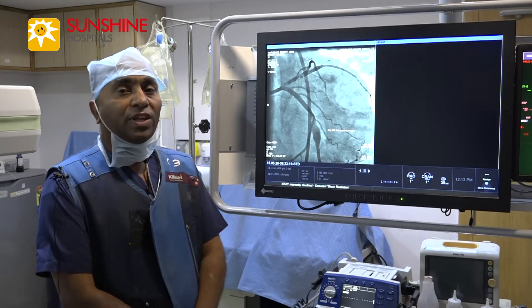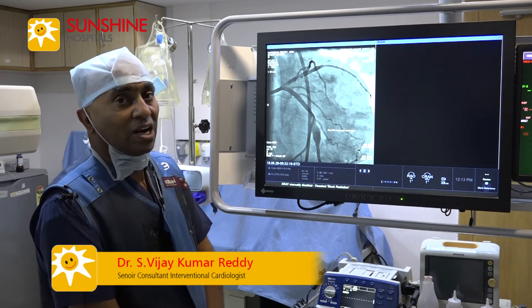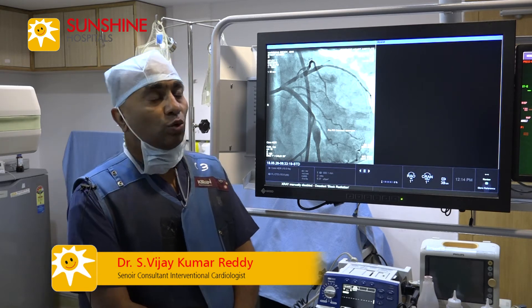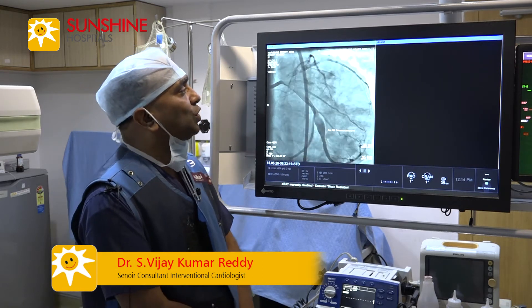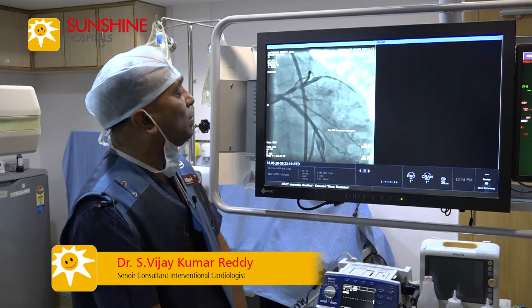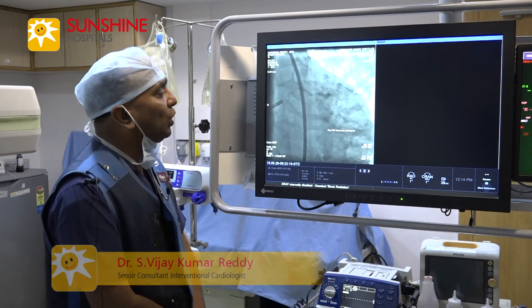I am Dr. Vijay Kumar Reddy, Interventional Cardiologist from Sunshine Heart Institute. This patient, Narsim Kumar Reddy, came with unstable angina. We need an angiogram.